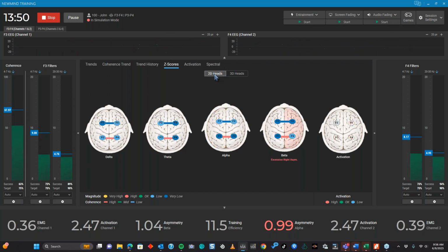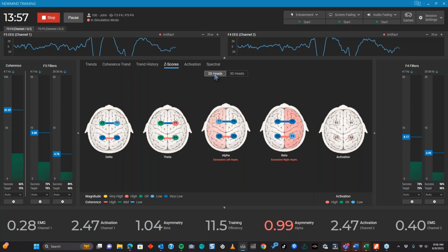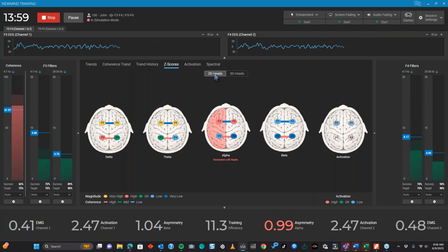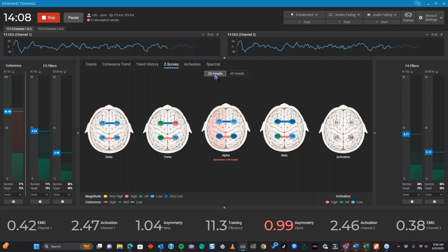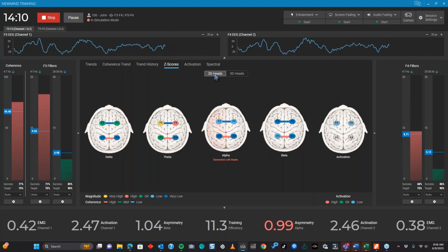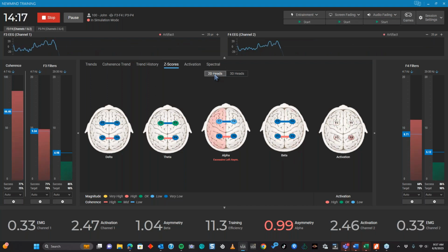You bet. And then my last question is, when you're showing the slides where you're talking about the different colors and what it means, if we do an initial map, and then we do a follow-up map, and it goes completely to the opposite and looks way worse for the client, how do we trust that we got a good map, or should we redo it, or how do we explain it to the client?